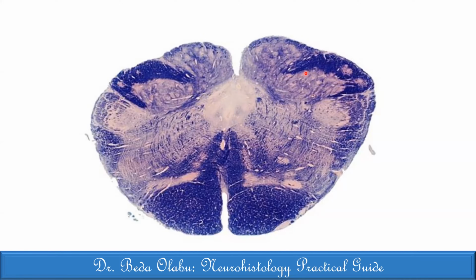So I think we are at the level of the closed medulla. That is all I can identify.